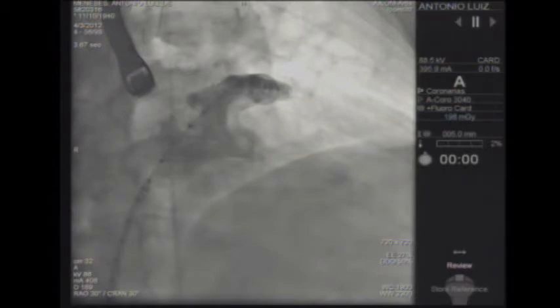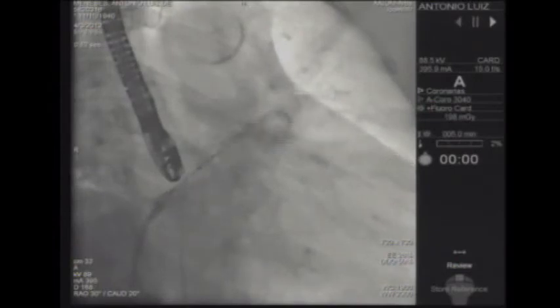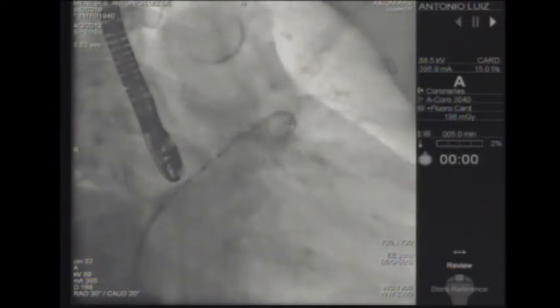So this is RAO cranial. I'm going to go to RAO caudal. This is a projection that profiles better the distal part of the left atrial appendage. It has a correlation with the echo projection at 135 degrees. So you can see the trabeculations of the left atrial appendage, and you can also appreciate the neck.